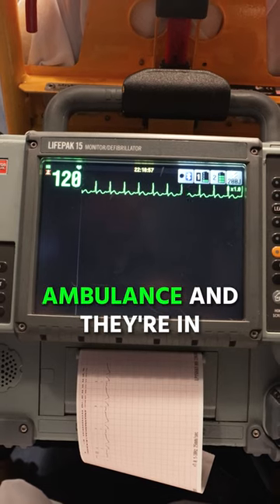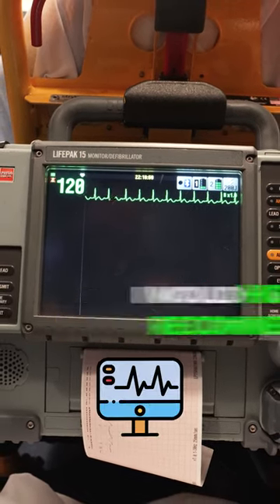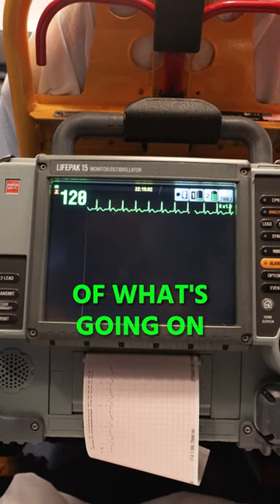If someone was in the ambulance and they're in sinus tachycardia, I would highly recommend getting a 12-lead EKG just to check the full picture of what's going on.